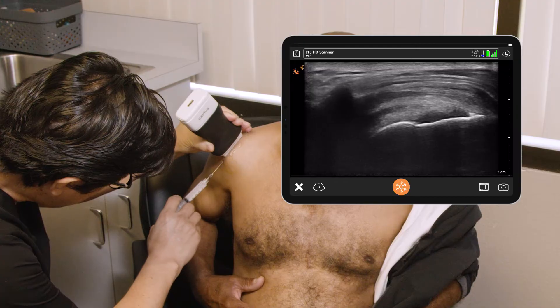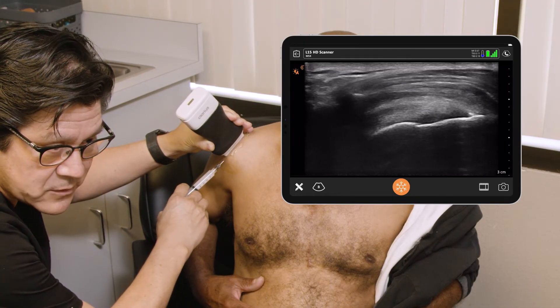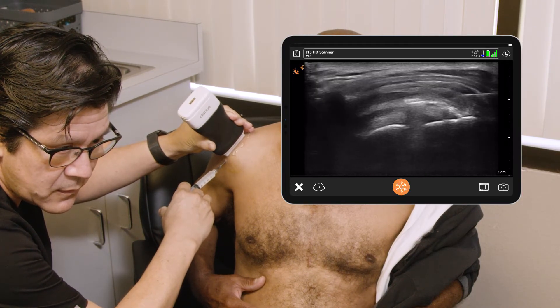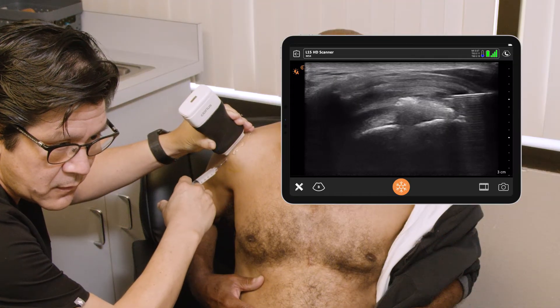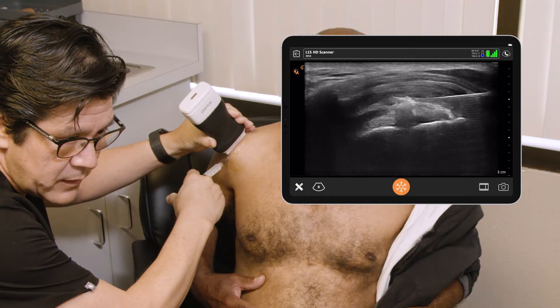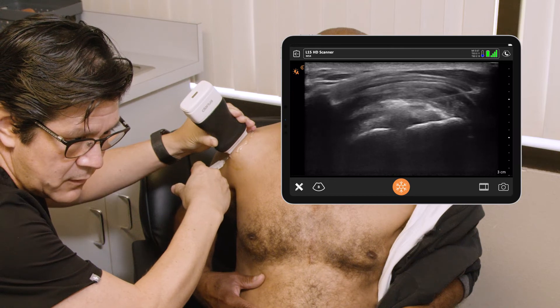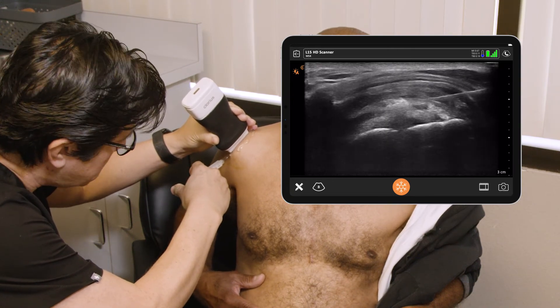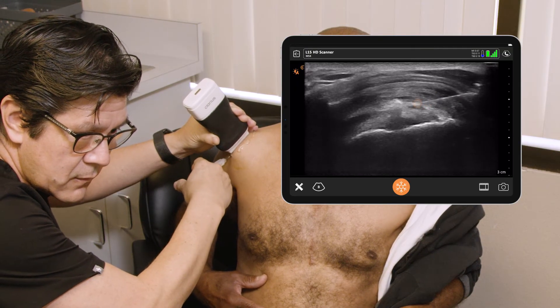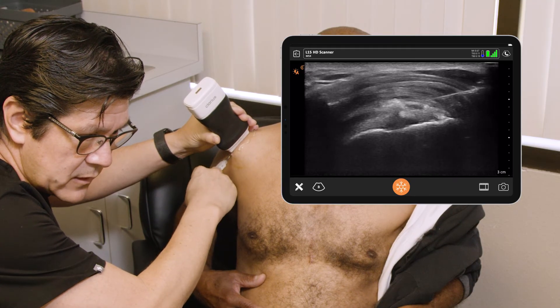Here we go — poke. You can see the needle coming in to our area nicely right there. I'm going to get into that spot a little bit better. There we go — that's spreading nicely there.